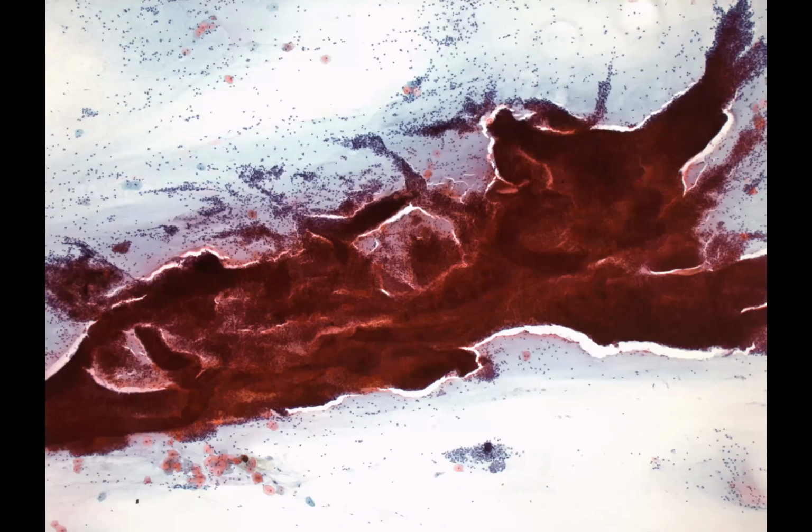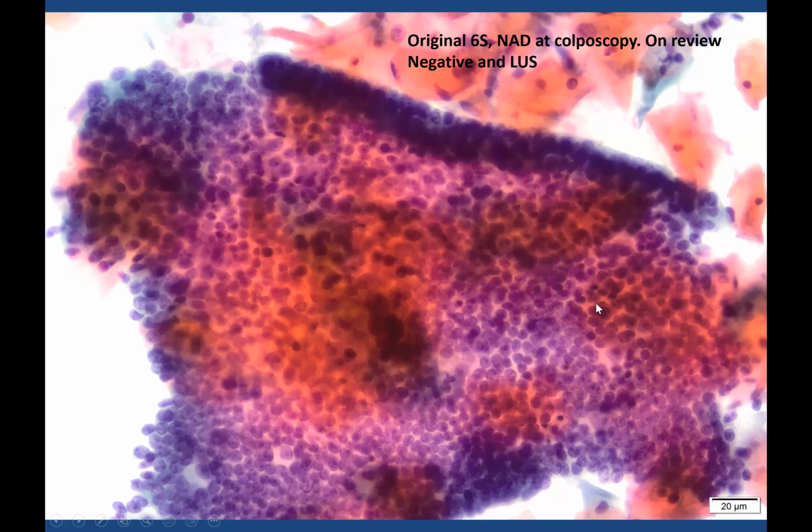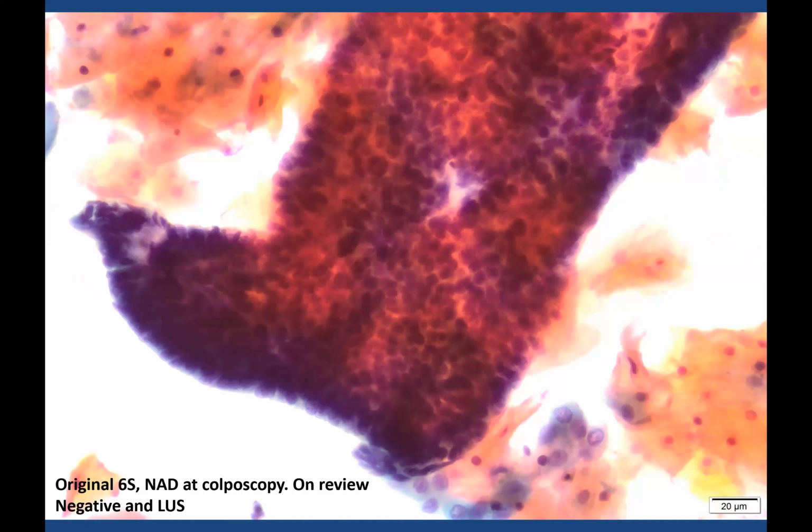Lower uterine segment, okay? At low power, you're seeing very structural organoid, almost microbiopsies, as you can see here. On a higher power, lower uterine segment, these are supercrowded glandular groups, and you can see that these are small crowded cells, very uniform with one another, but they have a very sharp punched out architectural look and usually a very sharp anatomical border to them. You may also see some stromal cells. In this instance, we've got a lovely crisp anatomical edge, almost looks like a boot.